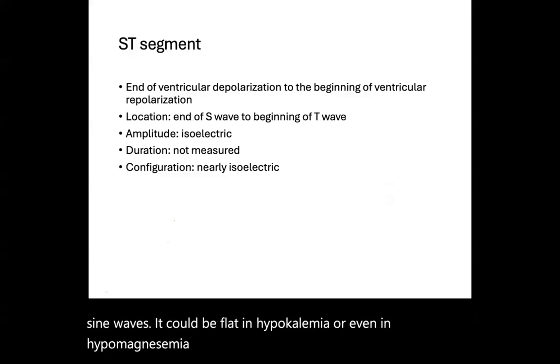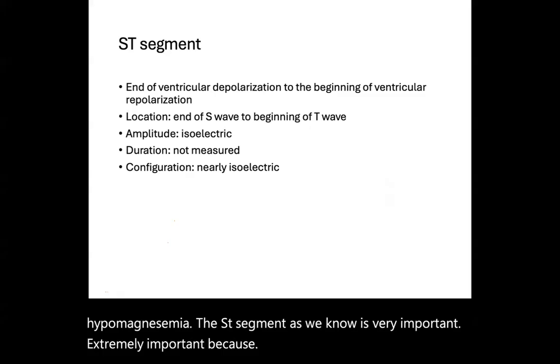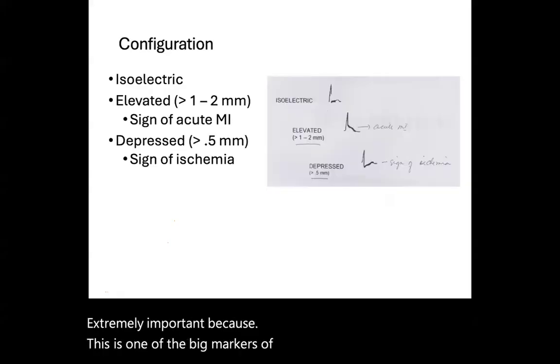The ST segment, as we know, is extremely important because this is one of the big markers of injury. There could be ST elevation or depression.